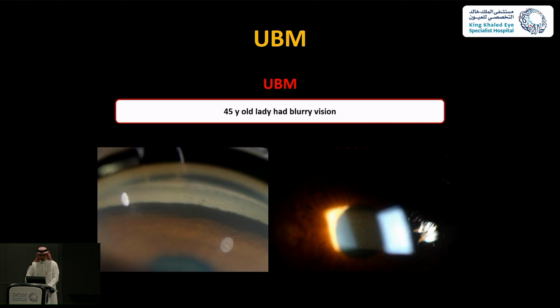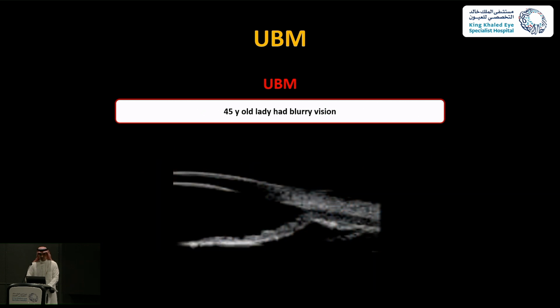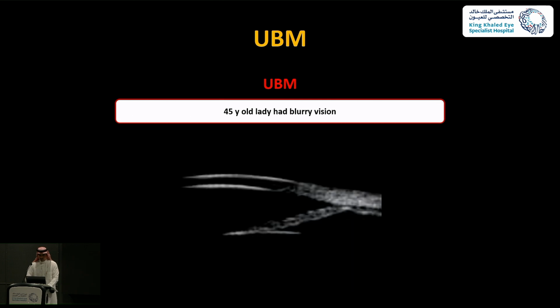Our last case is a patient who has pigmentary glaucoma. And as we mentioned before, you will have posterior bowing of the iris. And that's the flattening of the iris after doing YAG peripheral iridotomy to reverse the reverse pupillary block.